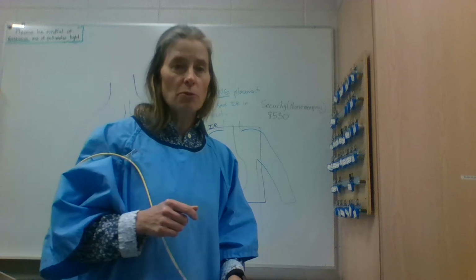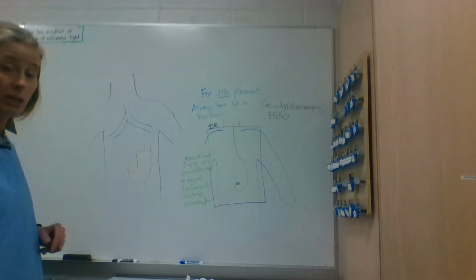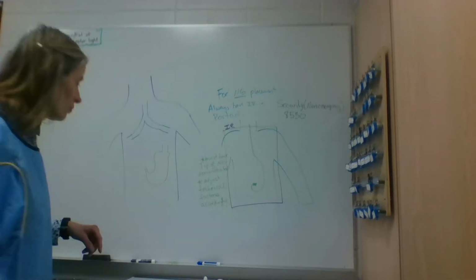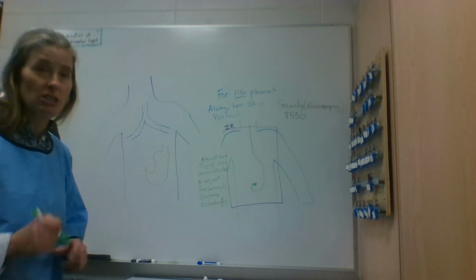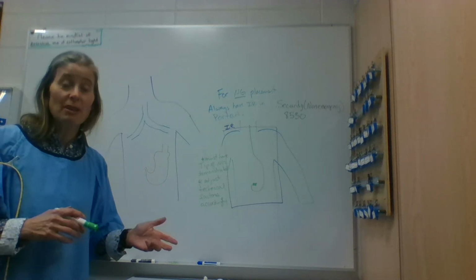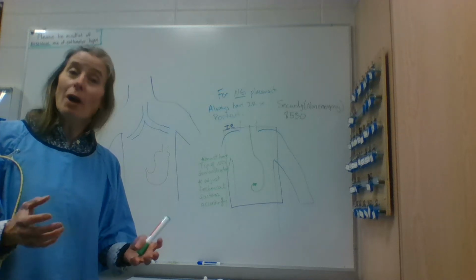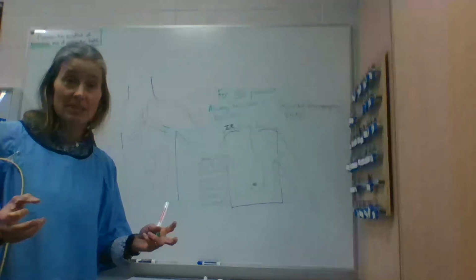So with the nasogastric tube, what's really important is that anytime you get a requisition, and it'll be just a regular chest x-ray, this is where we have to really pay attention to our requisitions, and we also have to make sure that information is provided as to why that x-ray has been ordered. Okay, so the clinical history or any previous history or what have you.